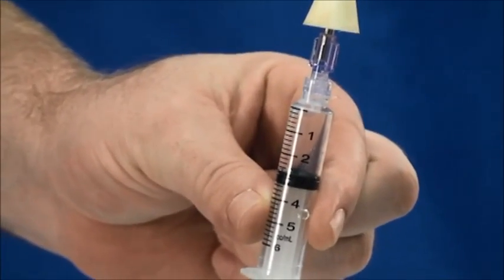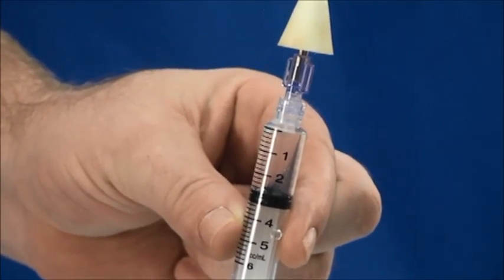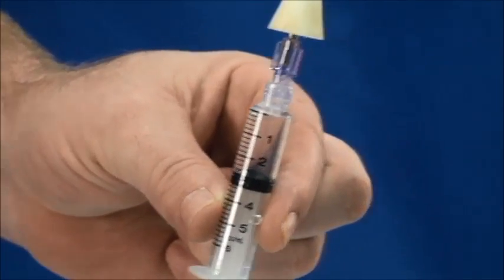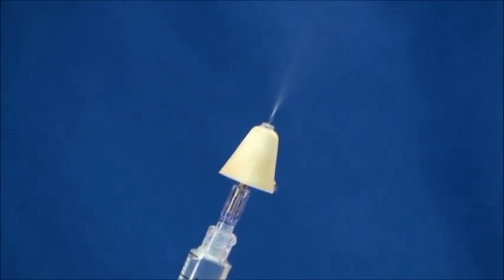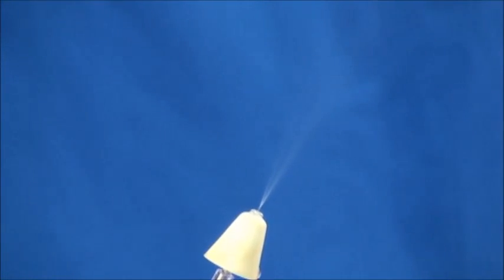I'll wait a couple of minutes to see how the patient responds. If the patient starts to breathe on their own, then I stop and won't give any more. But if the breathing does not return adequately, then I'll insert it into the next nostril and deliver the medication through the nasal atomizer.